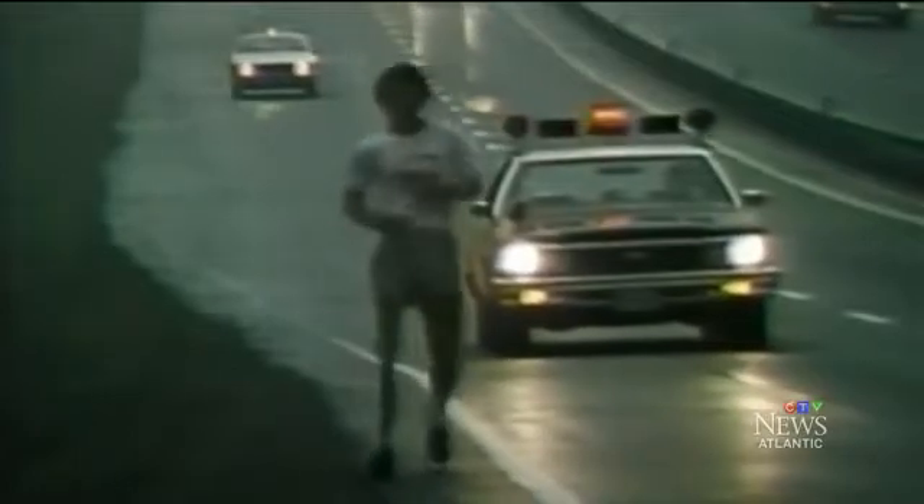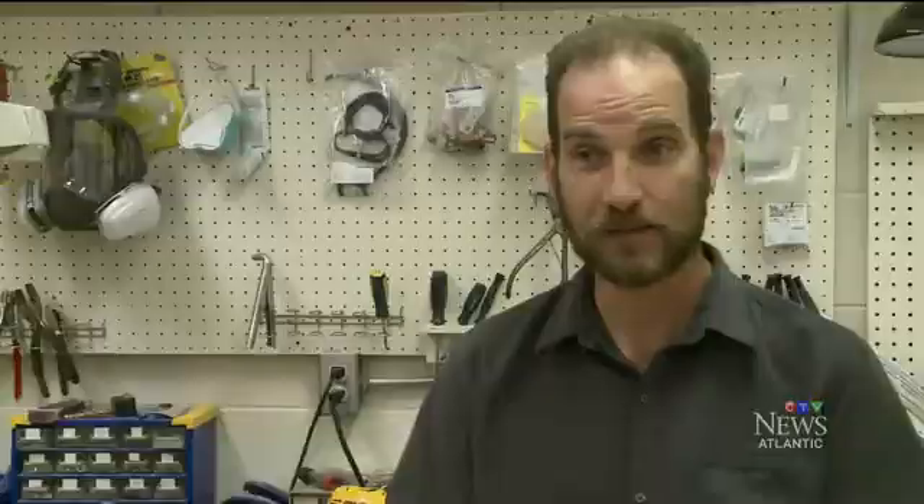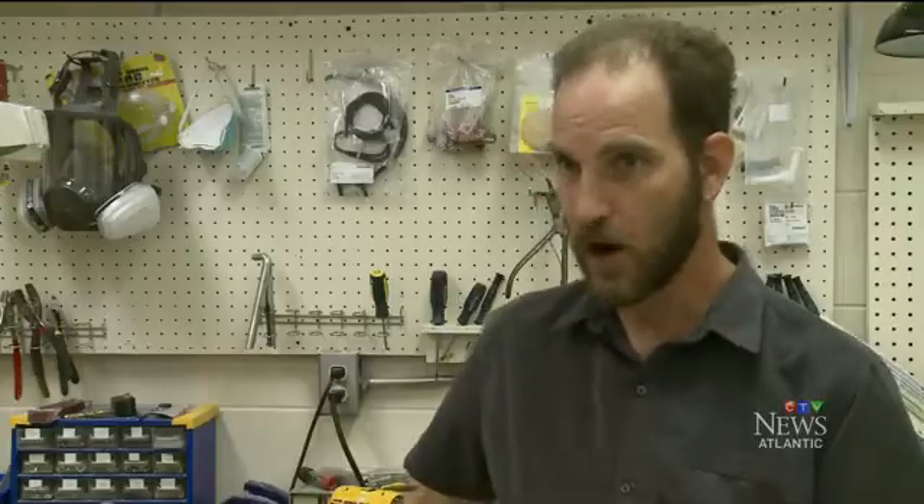He decided to complete a replica of Fox's artificial leg to give people a better idea of the magnitude of his run and show just how far prosthetics have come. "I think it would be painful running that far in that leg. And with the energy he had to use — he must have been exhausted. He wasn't running a 100-meter dash in a modern prosthesis. He was running up hills. He was running on the flats."